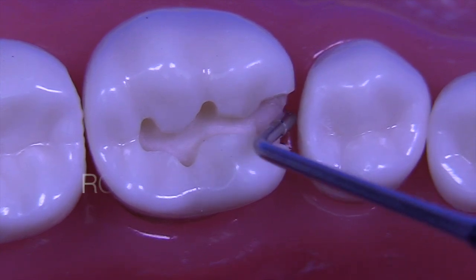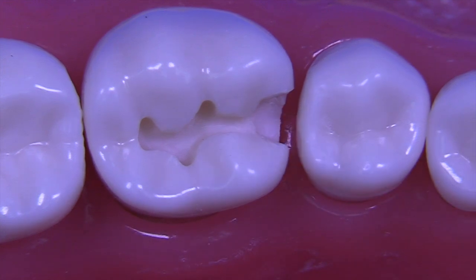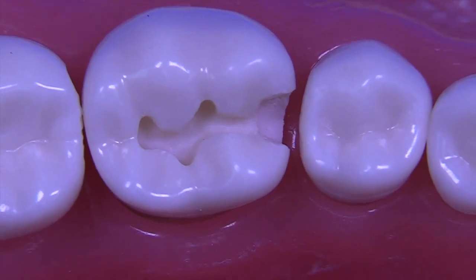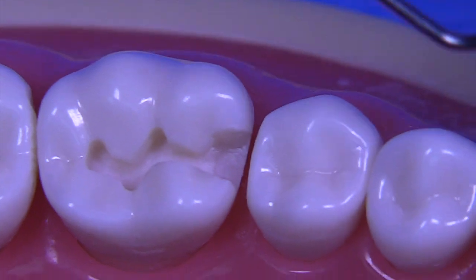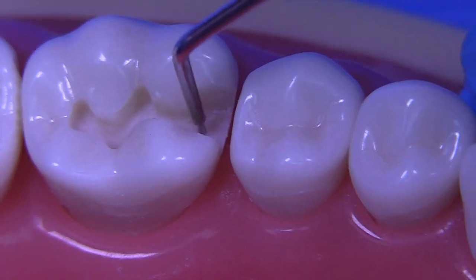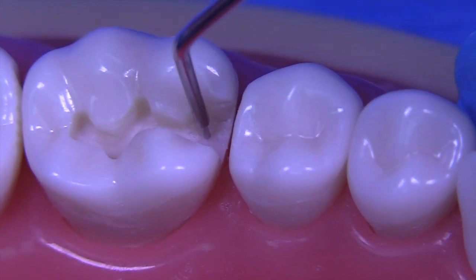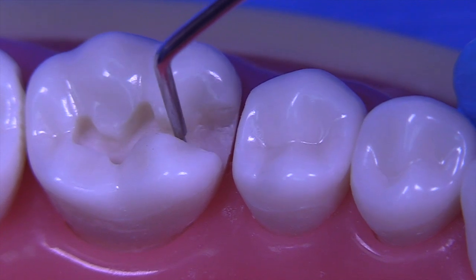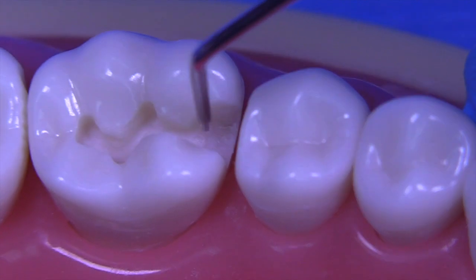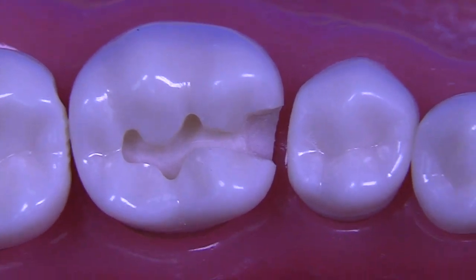You're right between that probably 0.75 to 1 millimeter range, and I think that that is quite acceptable. That does produce an axial wall height from the pulpal down to the gingival that is, in this case, about a millimeter. We'd like to see that a little bit taller, and that might be somewhat short because of the depth of the pulpal. But let's get back to that in just a minute.